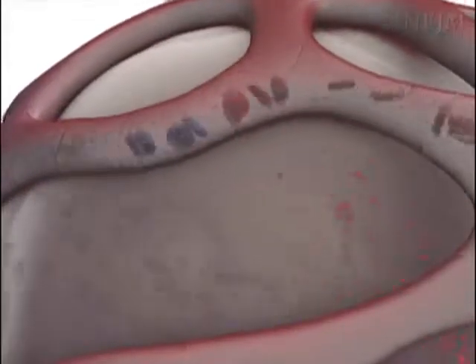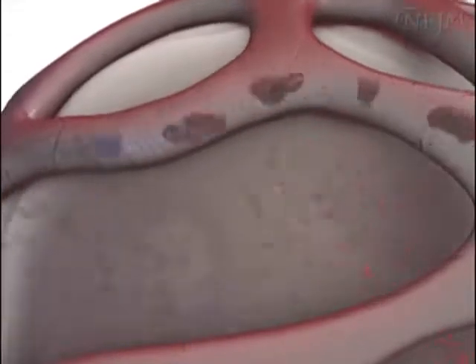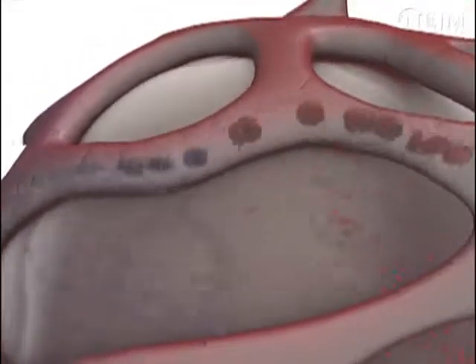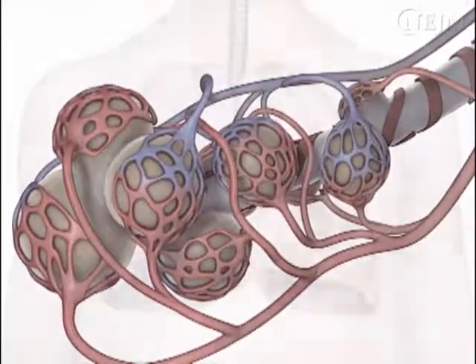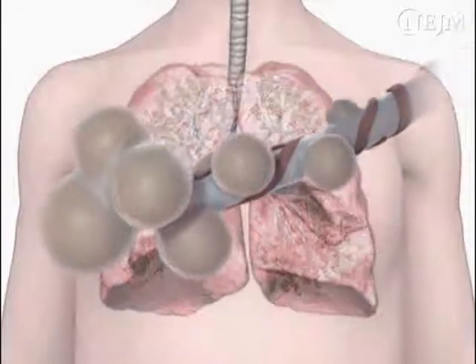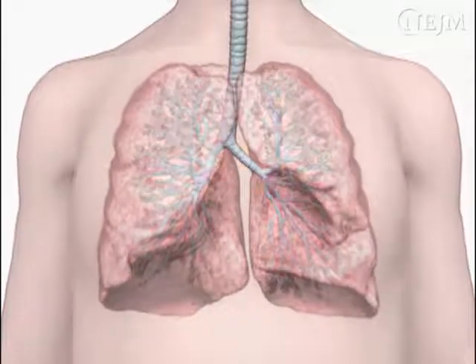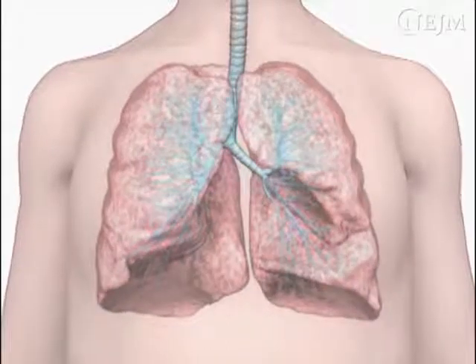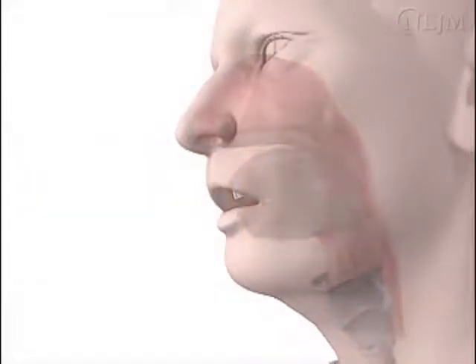Carbon dioxide is generated in the body as a metabolic byproduct. Carbon dioxide dissolves in the blood and is transported in the bloodstream until it reaches the lungs, where it diffuses into the alveoli. The alveoli are ventilated through an open tracheobronchial tree and a patent upper airway. Carbon dioxide can then be detected in the patient's expired breath. The measurement of expired carbon dioxide provides insight into important life-sustaining processes that include metabolic, circulatory, and respiratory activity.